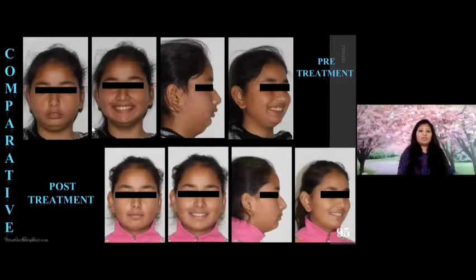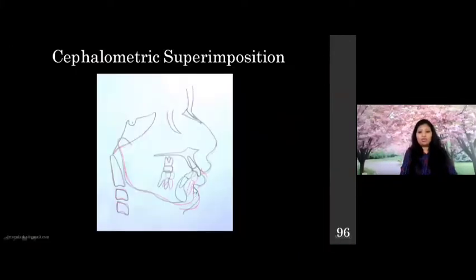So this was the cephalometric superimposition. You can check it out that the mandible has overgrown so much. The red color one is the post-treatment and the black color one is the pre-treatment. You can check out mandible has grown more or less pretty much forward.